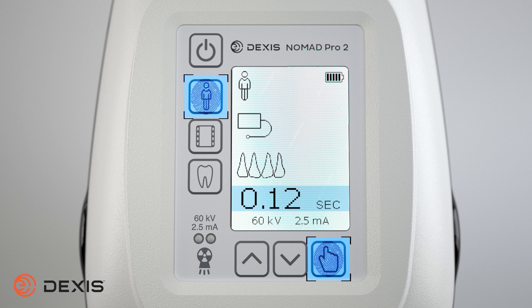As a security measure, the x-ray feature on the Nomad can be disabled or locked when not in use or when stored at the end of the day. You can lock the ability to trigger an x-ray by pressing and holding down the select button and then pressing the patient button. The device will change into an x-ray's locked state. Repeat this process to unlock the x-ray. While in a locked state, you have access to all features of the Nomad, you just won't be able to trigger an x-ray.